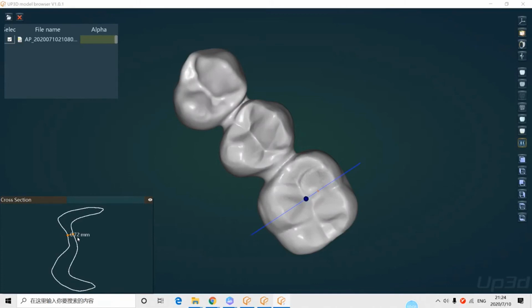It will soon be one of the most popular CAD software, because of our hardworking and humble attitude to learn from the newest and the best. We are proud to announce that this software is like our child. We give birth to it and we raise it. So hopefully it will grow bigger and bigger.